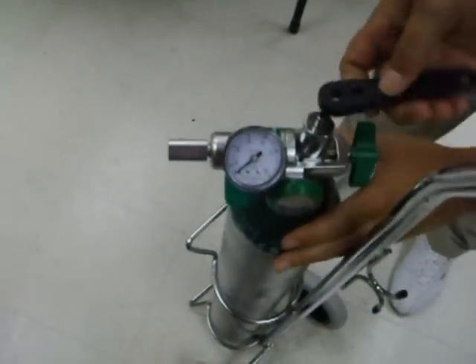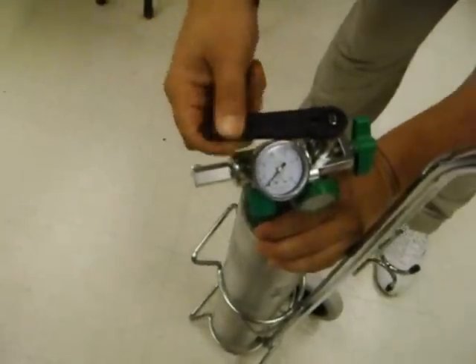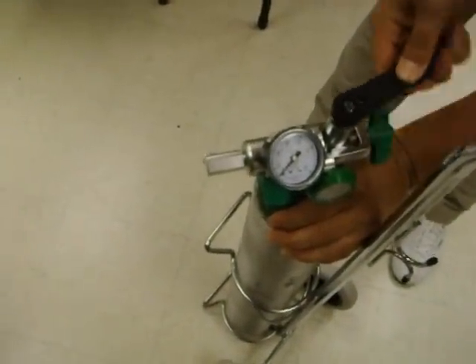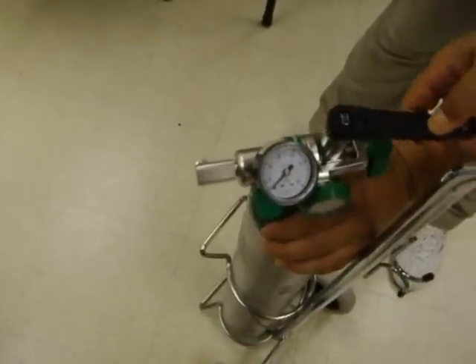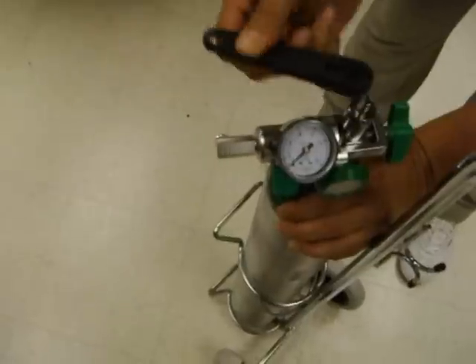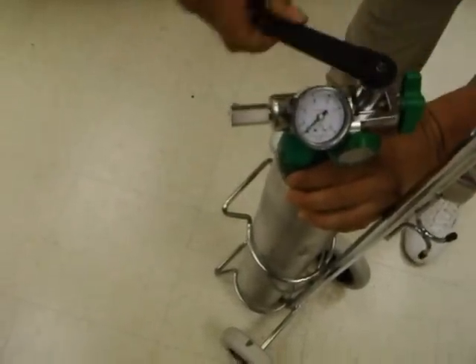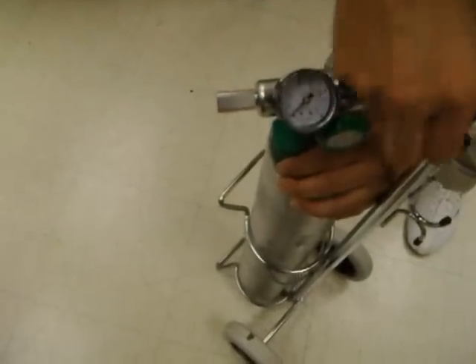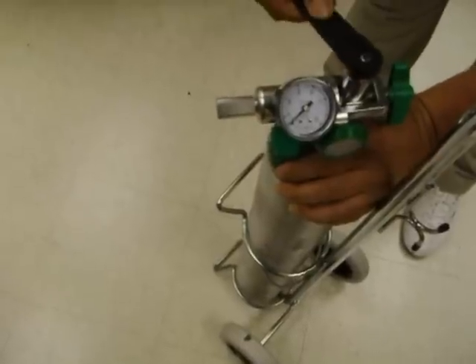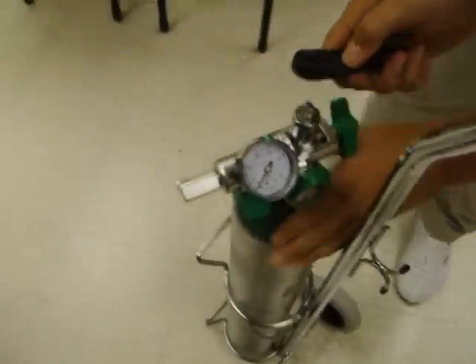Then we're going to open the valve all the way, ensuring that we don't hear any leaks — which I don't. Opening the valve, you're always opening it all the way, which is the longest part of the process. Once it's all the way open, back it off a quarter turn, and the tank is open.